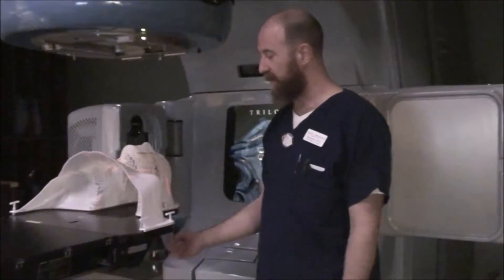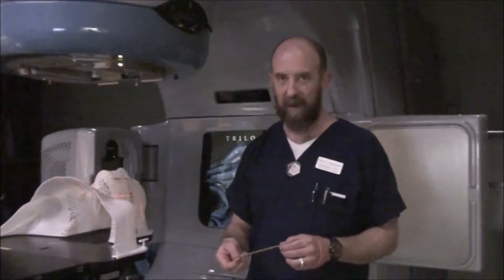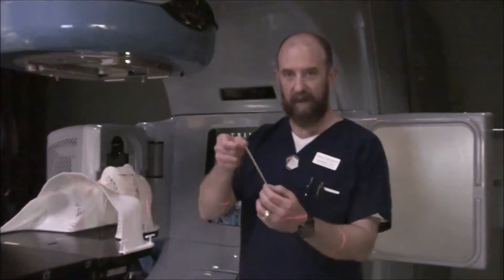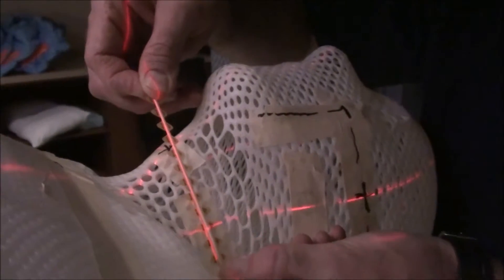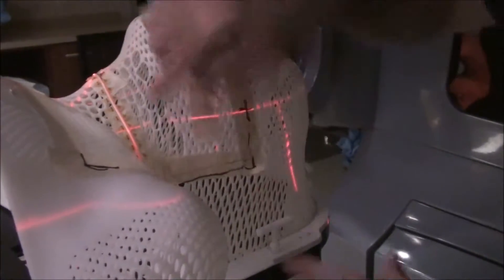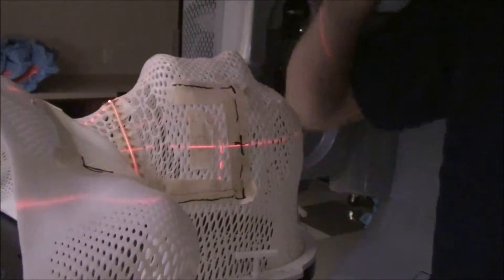What we want to do before we film it is add a wire. That wire is going to show where that match has to be radiographically. On the x-ray, DRR, or whatever we're going to do, we have to have a way to show exactly where that match was. I'm going to show you exactly how this works in real life. Since we're all on just one side, we're going to put it on the side you're facing from the camera. You're going to run this wire right along that laser — that's going to show our match line. It runs along that laser, which is our junction point between the lateral head and neck and the AP superclavicular.